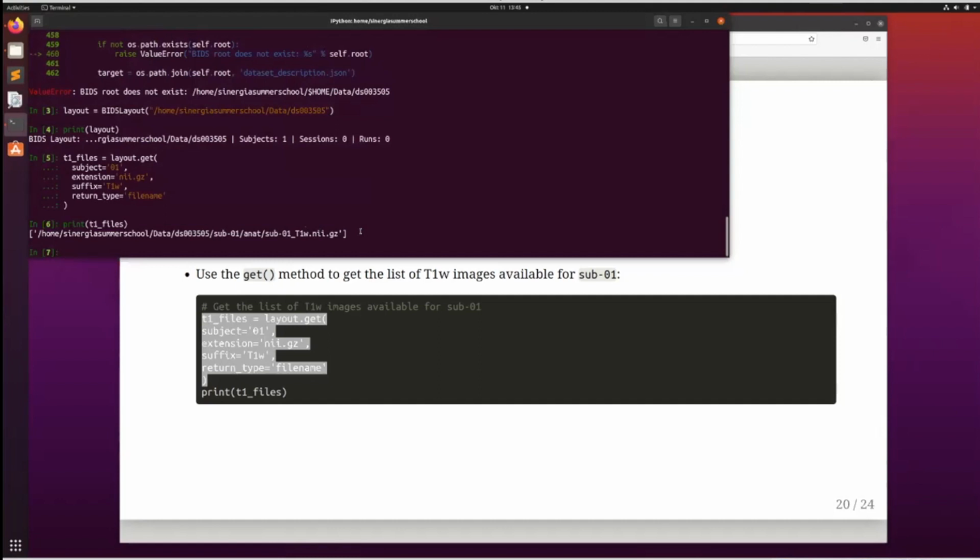And that's the power of BIDS: as long as your dataset is organized by BIDS, you can very easily generate file names and get files that exist, and not based on the assumption that the file is there with this file name when in the end it is actually missing. So that can really reduce errors from missing data or not finding the data.